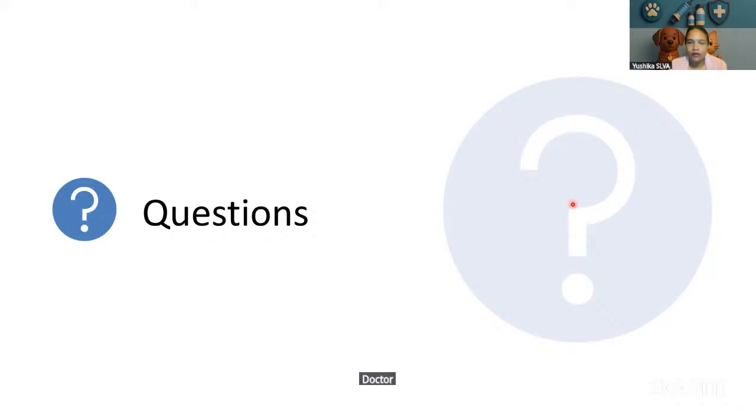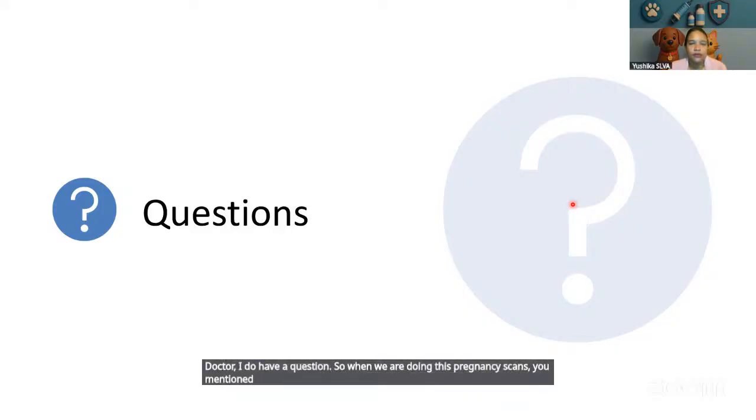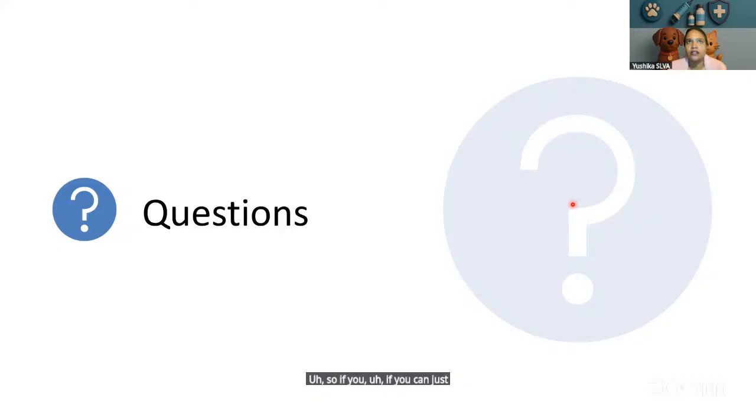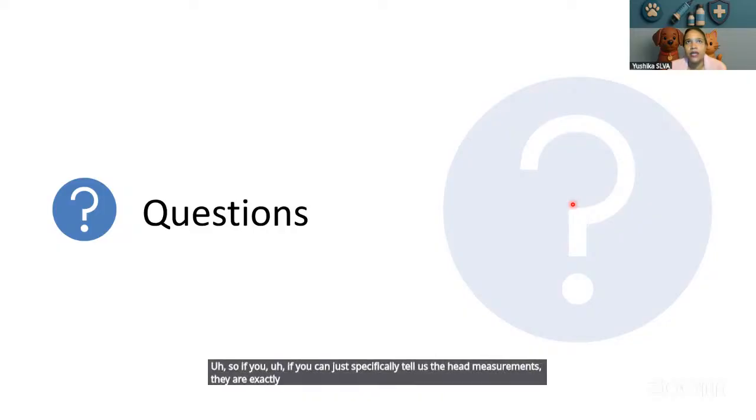Doctor, I do have a question. When we are doing these pregnancy scans, you mentioned that we do the measurements. If you can just specifically tell us the head measurements, where exactly the measurement has to be taken, and the body measurements, where exactly, that will be helpful.